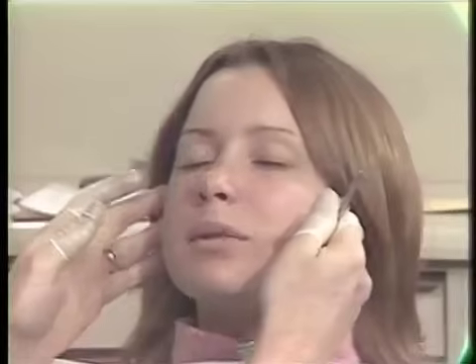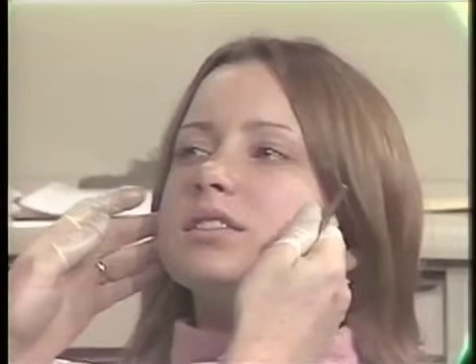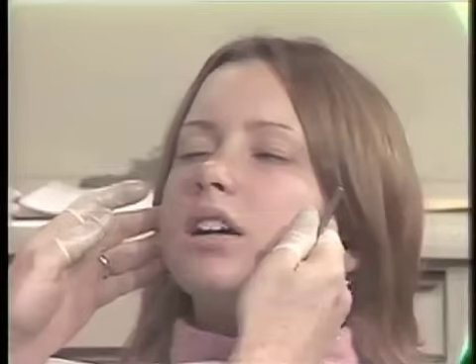Do you have any problems with your joints? No problems. No tenderness? No. Open and close. Sideways. Other way. Close. Thank you.